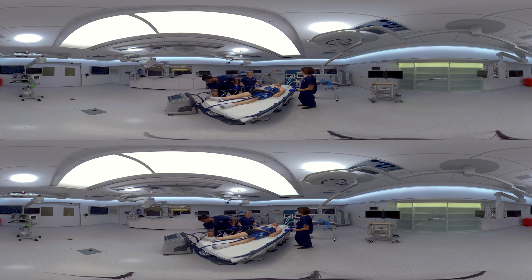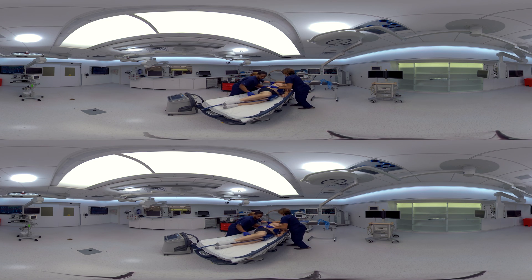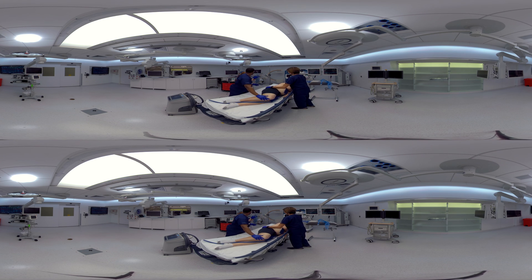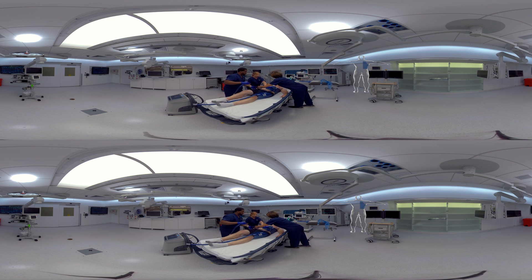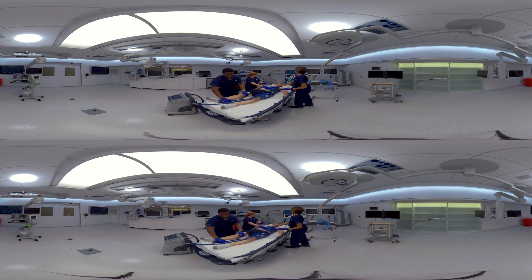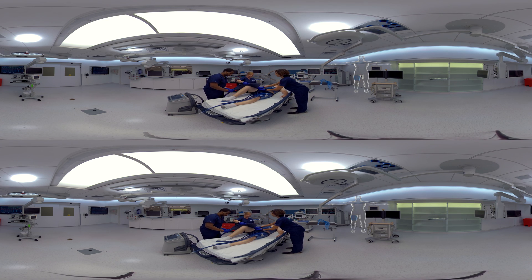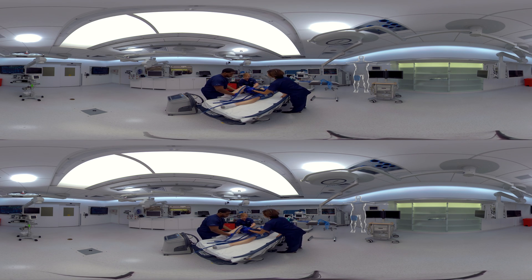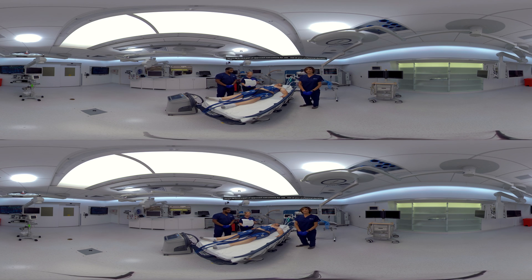You can lower the railing and we'll roll our patient to the other side. Once again, I'm going to line the long straight edge up next to his spine and roll him back over. The gel pads can go on top of defibrillator pads. We also want to ensure that the gel pads are in contact with clean, intact skin. If you have any sort of dressings on the patient, you can use these white, waxy strips of paper as a barrier between the skin and the gel pad.